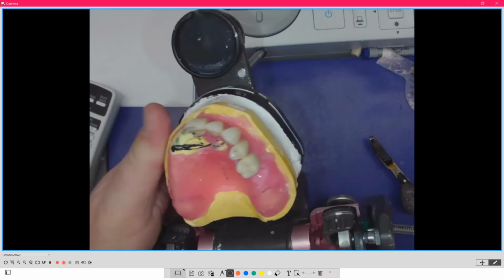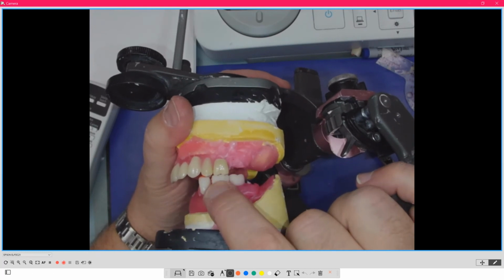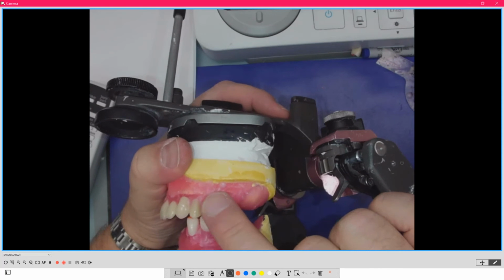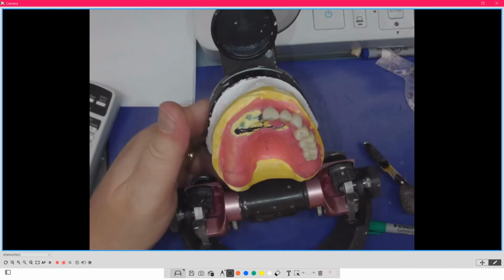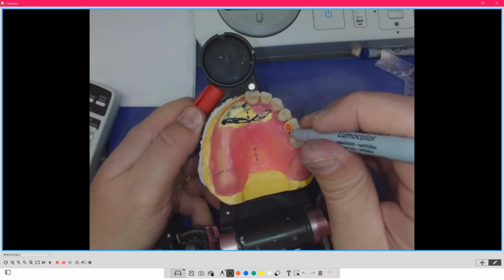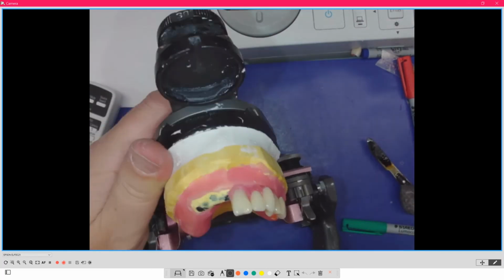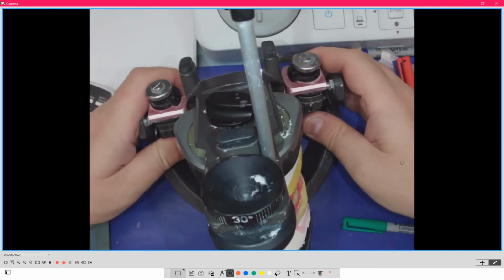So now I've grabbed an upper first molar and I've gone back in and touched it up so that it's in. And now I can do a second upper molar. And now I can facilitate what we would deem to be a little bit more of a standard tooth arrangement. Now it's the same thing where I would go in and color these lingual cusps that are the cutters. But remember, the cutter on the bottom is always on the lower first premolar. And then I would do my centric tap, and then I would unlock the articulator.